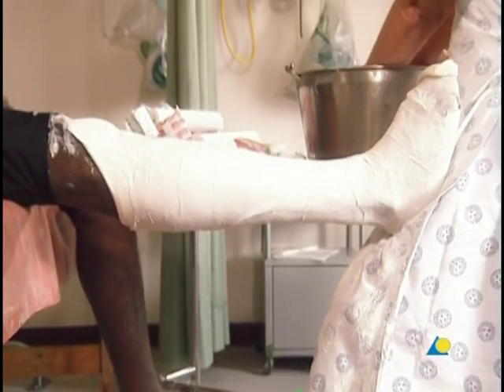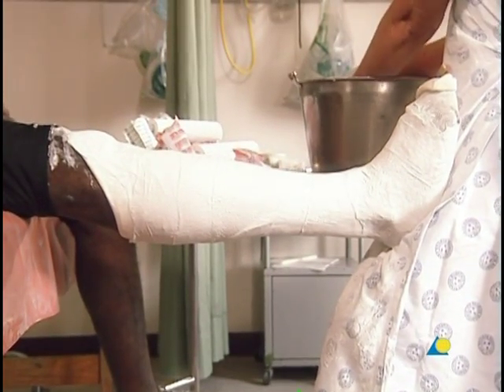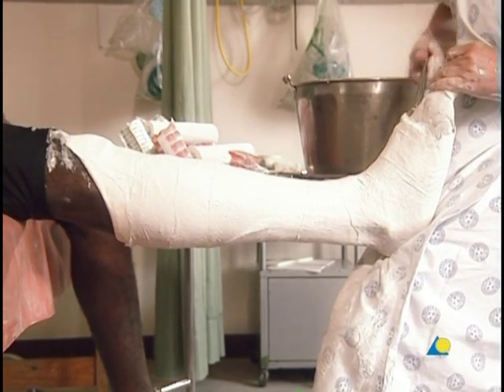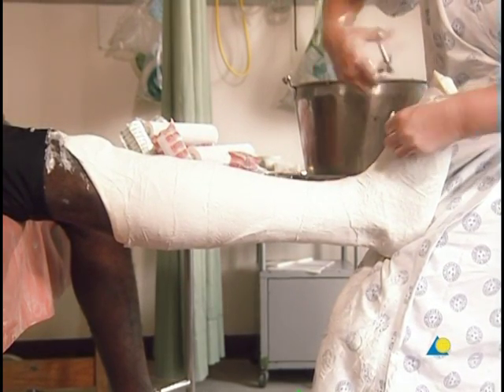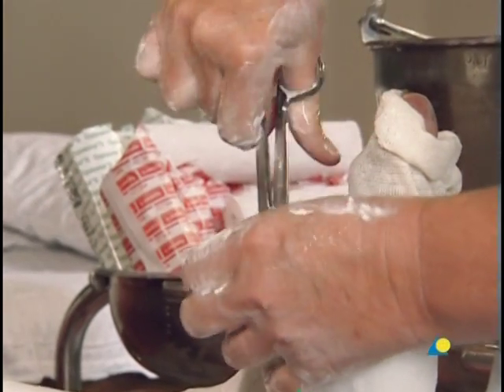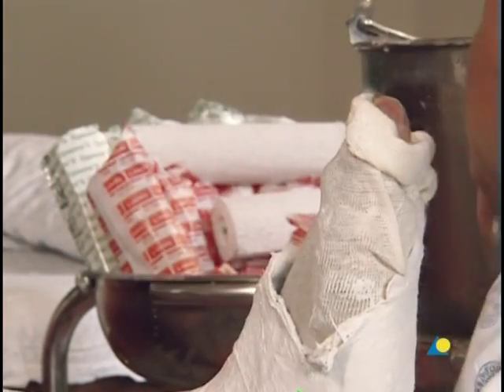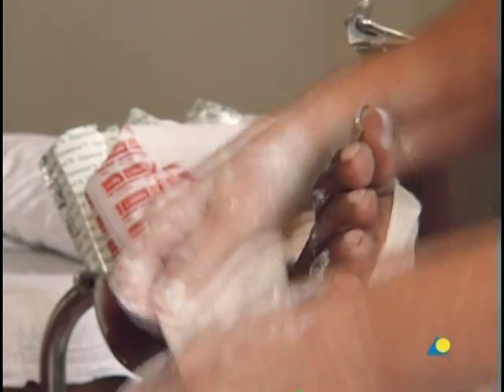The extra plaster covering the toes should be noted, as it ensures there will be adequate support for the metatarsal heads. The excess plaster is now removed with scissors, and the stockinette at the distal end is cut and folded back to reveal the toes.